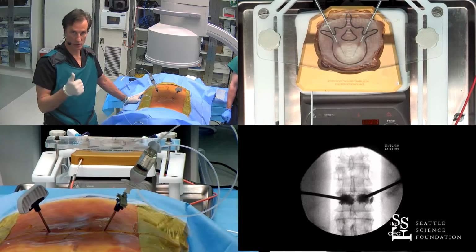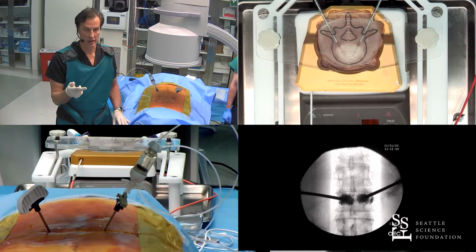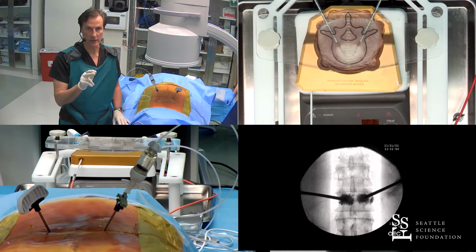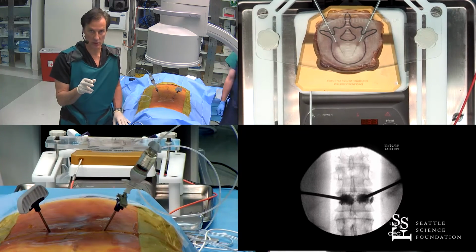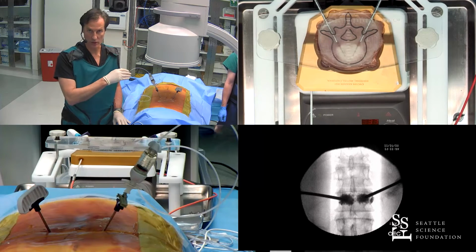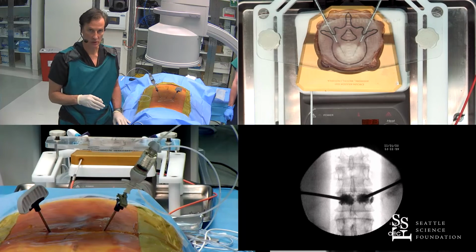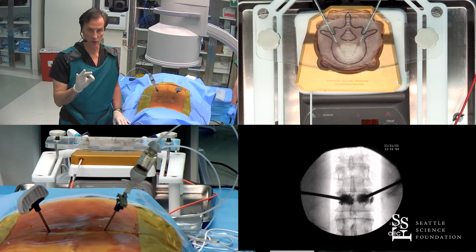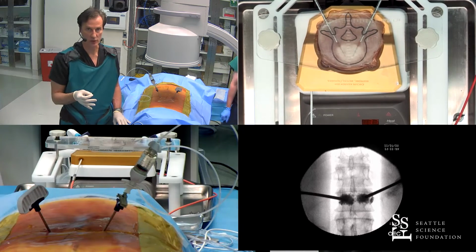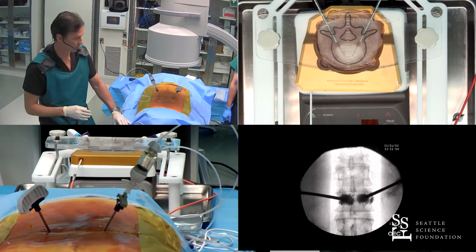So 4 different approaches: transpedicular, parapedicular, extrapedicular, and I'll pause right there to say don't use extra and parapedicular loosely. Parapedicular means around the pedicle, and extrapedicular means outside the pedicle. So this really should be reserved for what I demonstrated to you. There are a couple of other arcane and esoteric approaches, but these are the 3 main approaches, and then the 4th is down the barrel, or gun barrel, or en face view, straight down the pedicle, usually at 20 to 30 degrees of ipsilateral oblique.